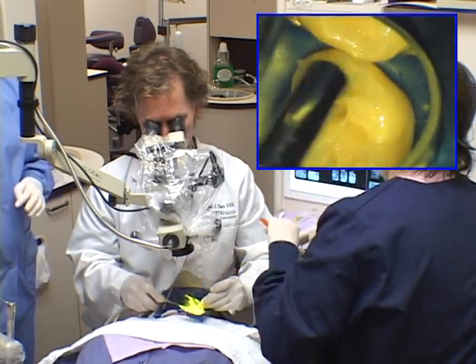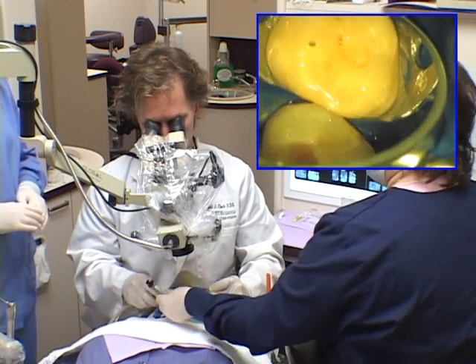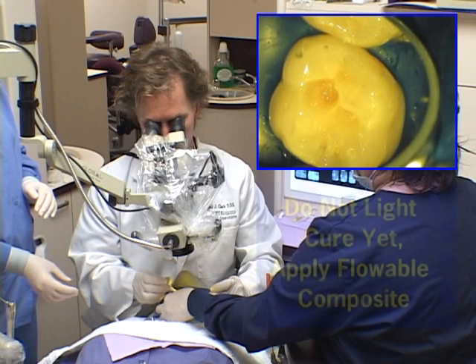I am thinning the lightly filled resin with a dedicated air syringe, which has no water input, so it has less chance of moisture contamination.